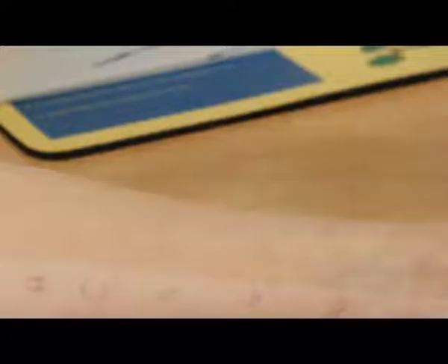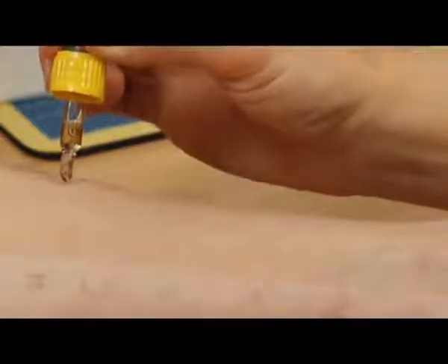If you twist your arm that way, now that might start to get itchy. Try not to scratch, because then it just means that we can't read it. Because what we're looking for is, you know when you get an insect bite? You get that lump in the middle and then the redness around the outside. It will come up like that. But what we measure is the lump in the middle, and anything over three millimeters is a positive reaction.